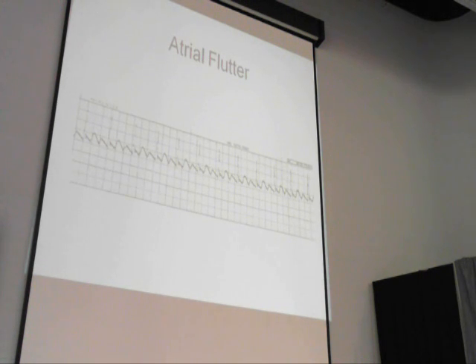So there's sinus dysrhythmia, sinus bradycardia, sinus tachycardia. The names kind of explain what's going on. Look for underlying causes. Then there are the atrial dysrhythmias: atrial tachycardia, atrial flutter, atrial fib. And like we said last semester, healthy hearts don't flutter or fib.